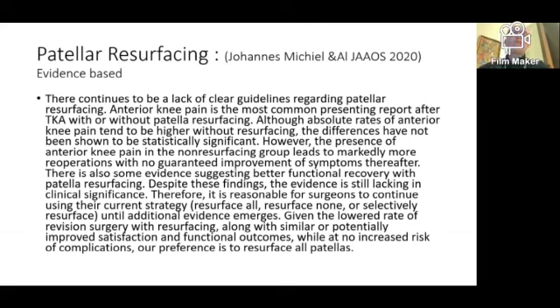Resurface, not resurface, or selectively resurface. I am one of the people who go for selective resurfacing. If you want to do a total knee arthroplasty and the femoropatellar joint is good, I do not resurface the patella, in my opinion, until additional evidence emerges. Given the lower rate of revision with resurfacing, along with similar or potentially improved satisfaction and functional outcome, at no increased risk of complication, some prefer to resurface all patellae, but I think that selective resurfacing is the goal.